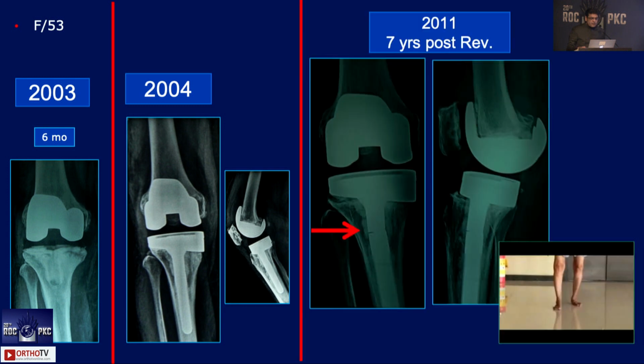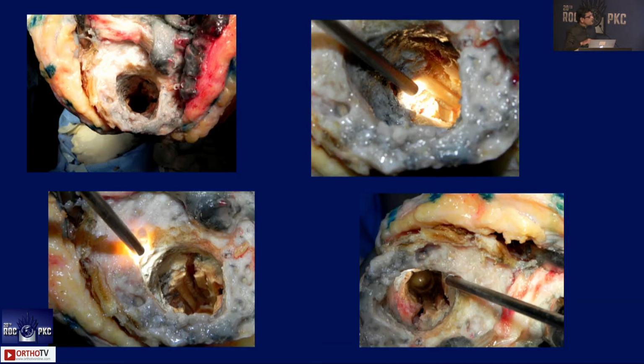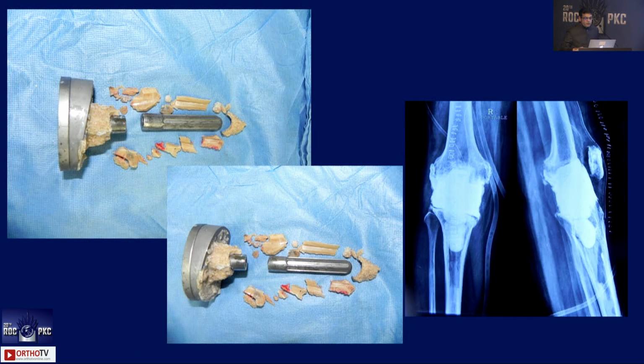One last case, very interesting. The patient had a revision by the primary surgeon in just 1 or 2 years, and the stemmed component, and I'm showing this so that, this is an uncemented stem that the primary surgeon had cemented completely, and that's the nightmare. Taking that out is a nightmare, and it broke. That's when I saw her. It was a tough job because this came out easily, but getting the rest of the cement out was really a nightmare. Luckily, we have this intramedullary light source, and it helped me get every bit of the cement.